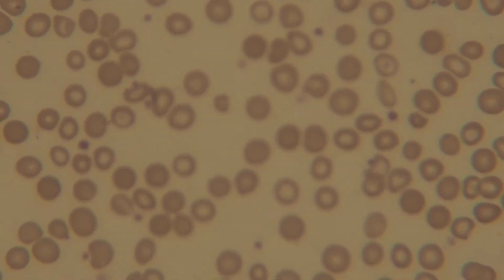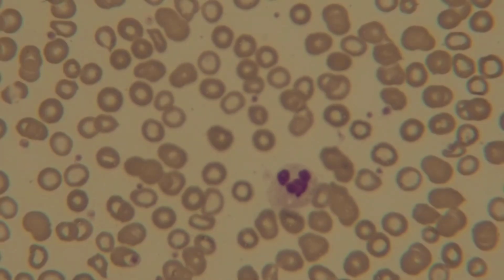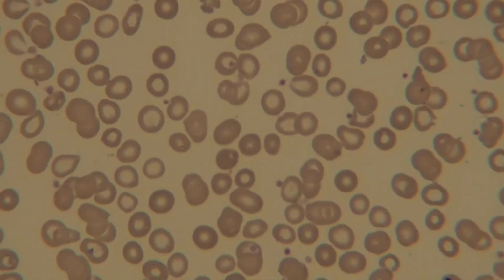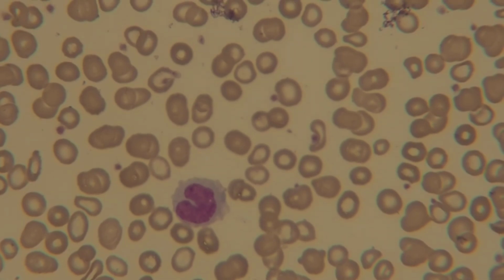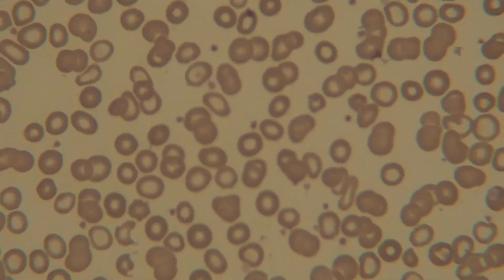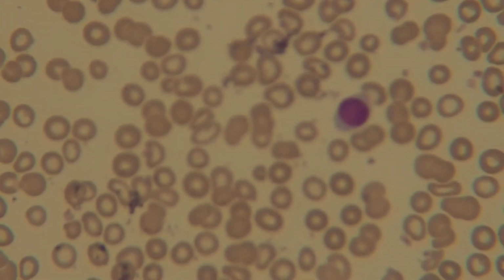That's the same cell. Let's go to another area of this slide because I think we're backtracing. Neutrophil, monocyte, neutrophil, lymphocyte.